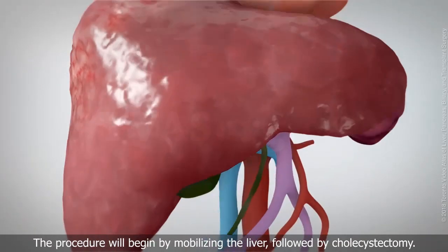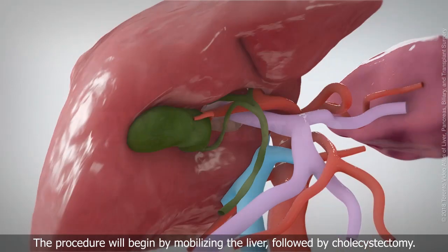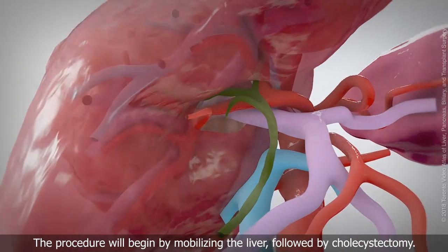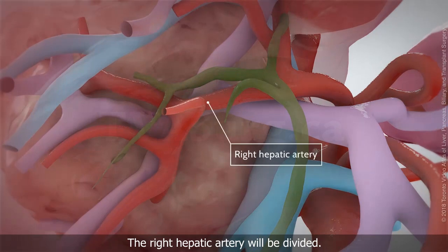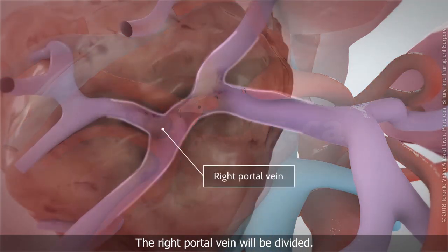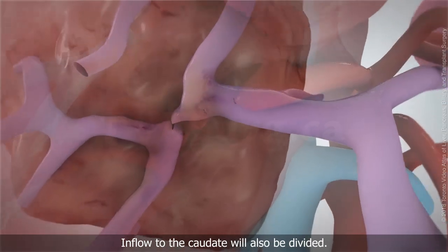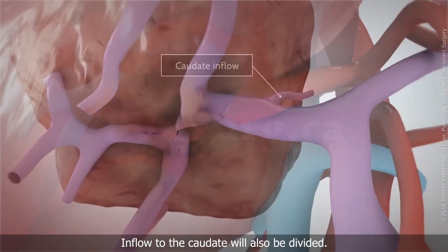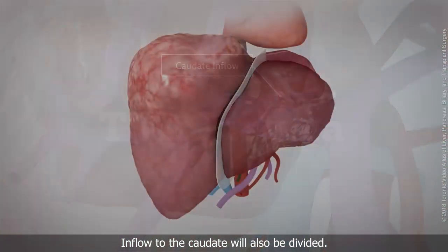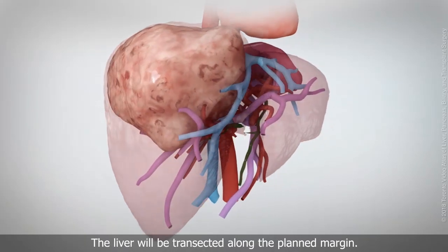The procedure will begin by mobilizing the liver, followed by cholecystectomy. The right hepatic artery will be divided, the right portal vein will be divided, and inflow to the caudate will also be divided. The liver will then be transected along the planned margin.